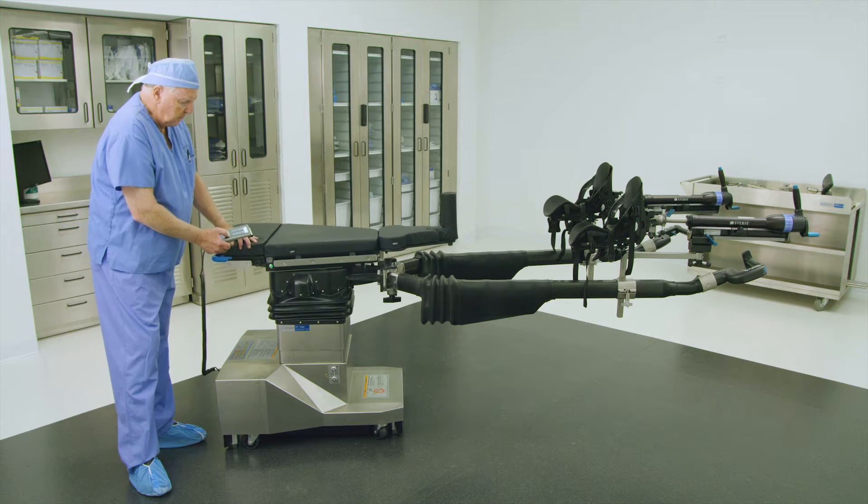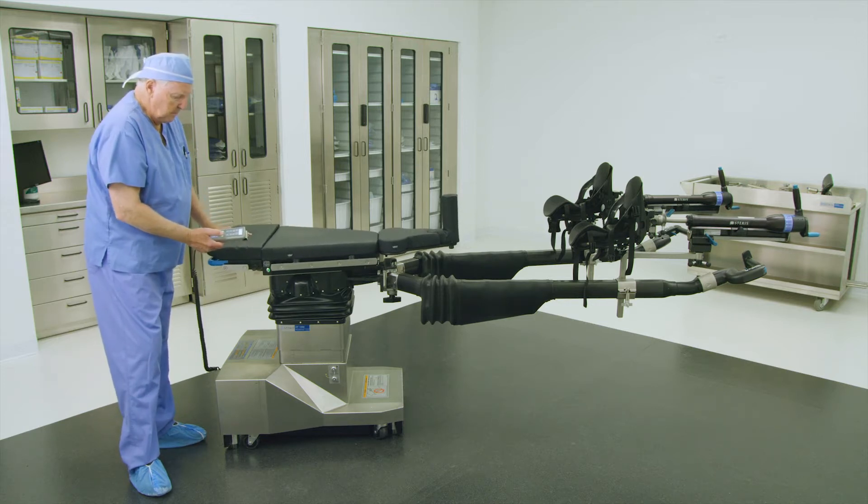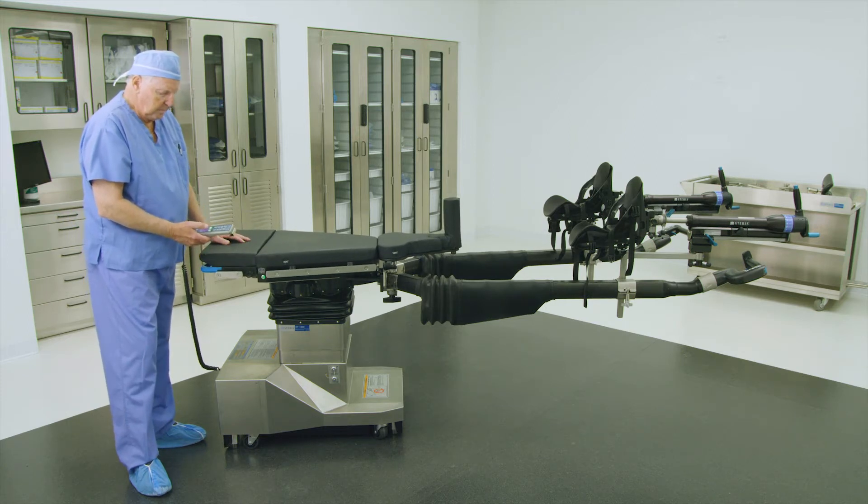The tabletop can slide in a transverse fashion from left to right to accommodate patient transfer onto and off of the table, to expose the surgical site, or to expose the anatomy for C-arm imaging purposes. The tabletop must be leveled before manual unlatch buttons are available for use.